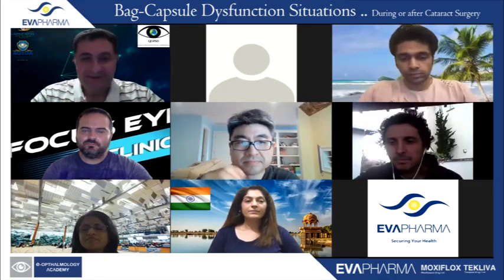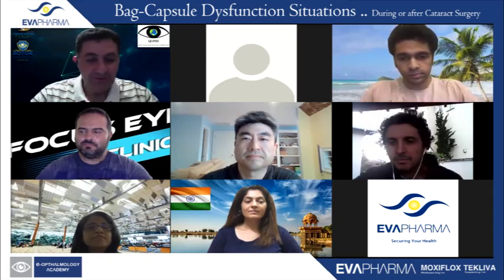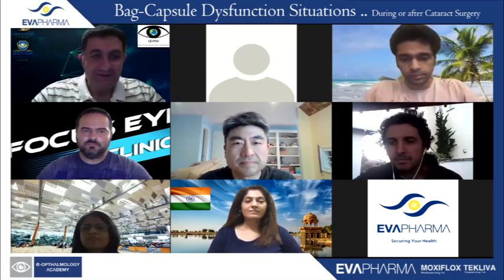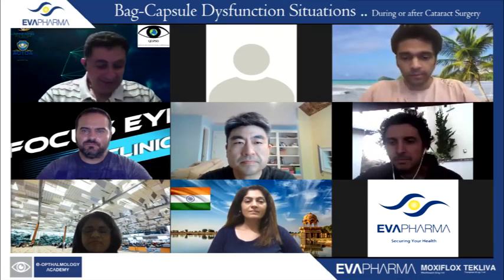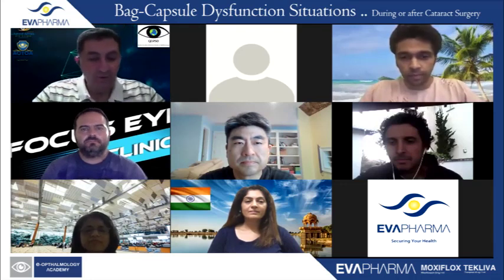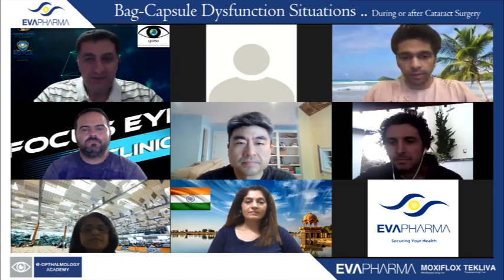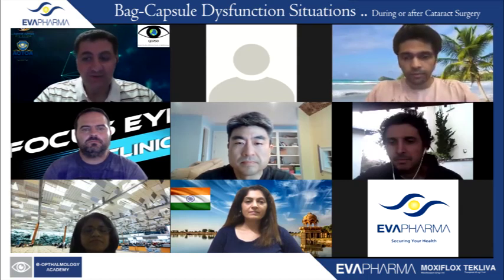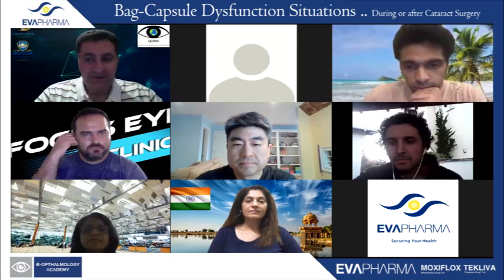So we are going to have this different webinar. I'm going to moderate this with my friend Ashvin. We're going to share the moderation. Hi, Ashvin. This is a special webinar. We're going to talk about all the issues about the bag capsule dysfunction situation. Either you can preserve the bag, or you have an abnormality in the bag, or you don't have a bag. What can you do, and what are you going to replace it with in different situations?